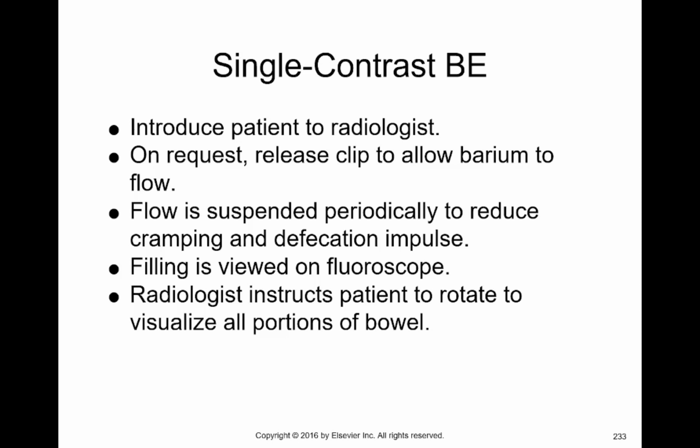You've spoken with the radiologist, and you've talked about the patient's history and what's going on with the patient. Now you are in the room with the patient, and the radiologist or the PA or the RA shows up. When I say radiologist, I'm including anybody who may be performing the job of the radiologist, in this case running the fluoroscopy.